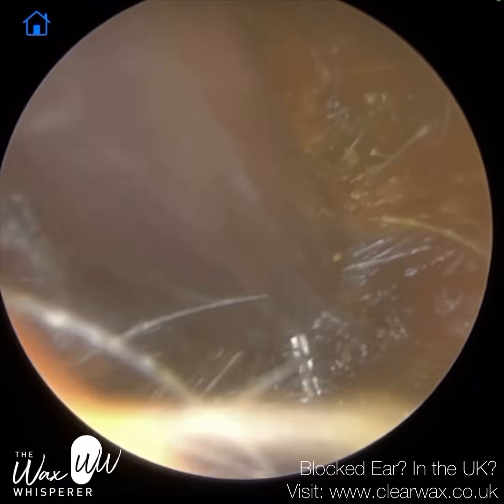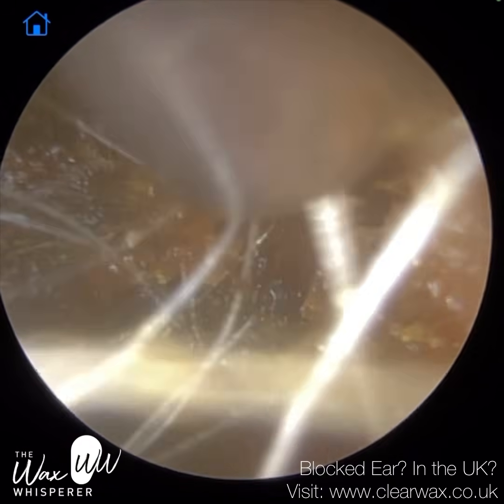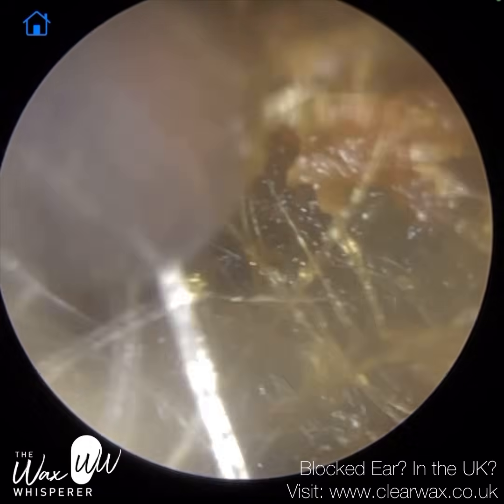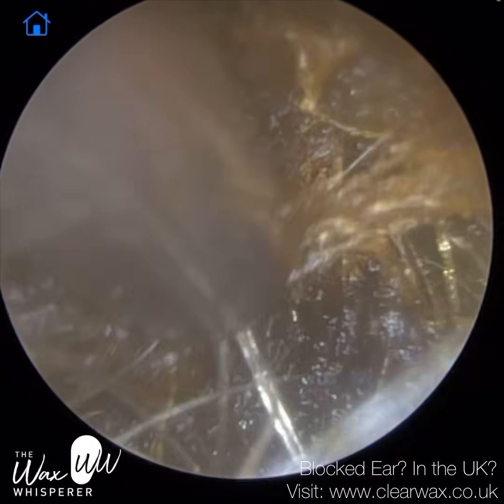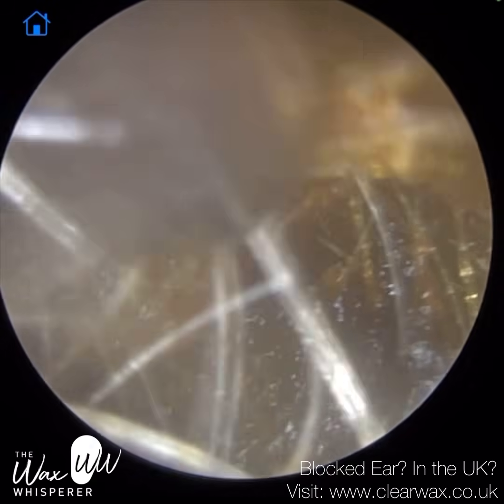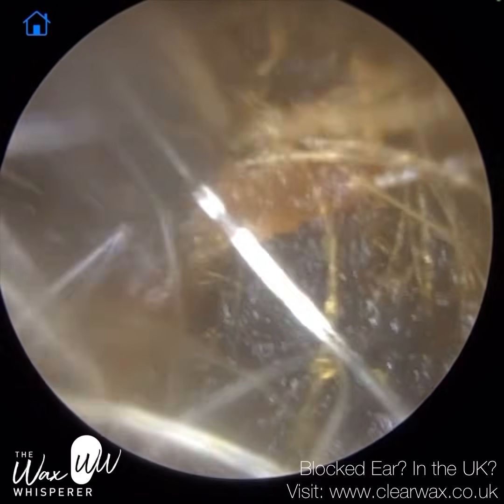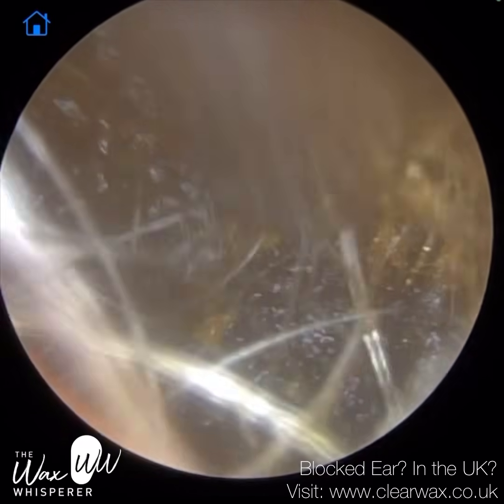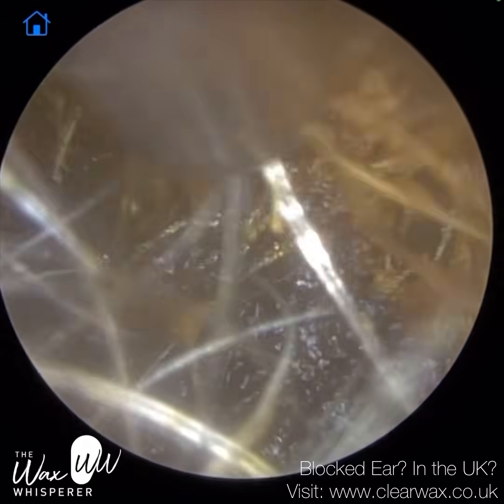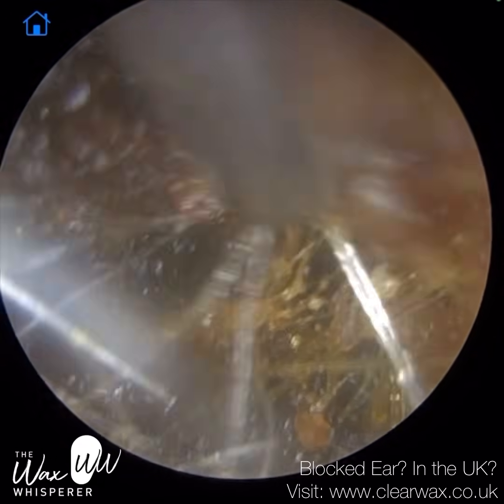The most common causes for these hairs to be deeper in the ear is if a patient is trimming the hairs around the ears. These hairs can quite easily then fly into the deeper parts of the ear. And also if someone's using a cotton bud, you're almost plucking the hairs out of these ears as you are circulating inside the ear with the cotton bud and then pushing it further in.